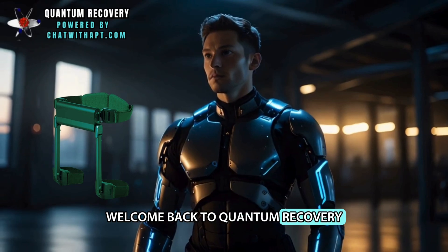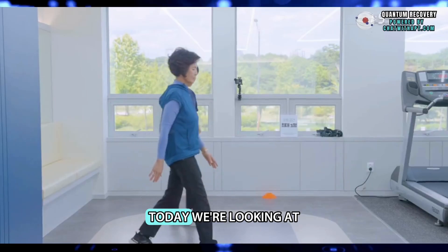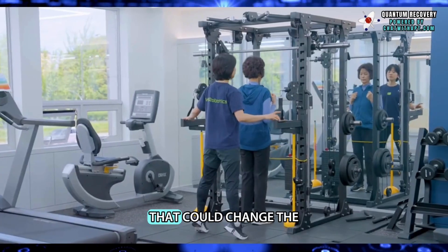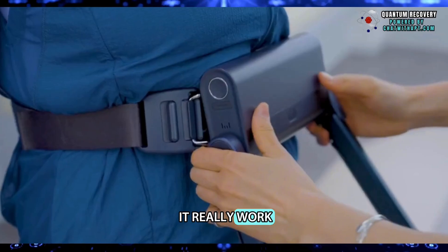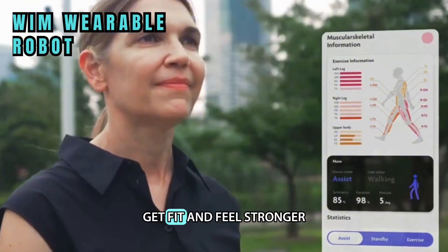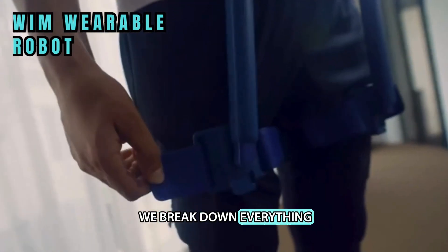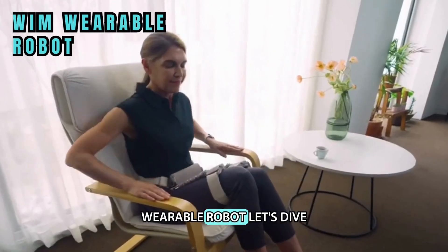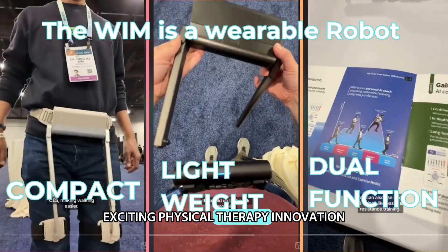Welcome back to Quantum Recovery, where we explore the latest tech designed to improve your life. Today, we're looking at a wearable robot that could change the way we move and exercise. But does it really work? Could this be the tool that helps you walk better, get fit, and feel stronger? Stay with us as we break down everything you need to know about the WIM wearable robot. Let's dive into this exciting physical therapy innovation.